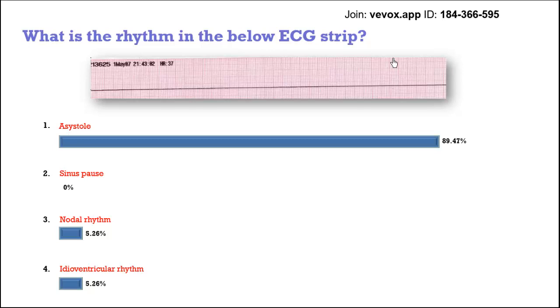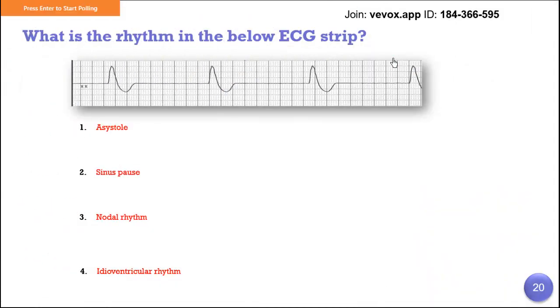But I told you before, once you see something like that in your patient's monitor, go and check the connection first. Second, you check the carotid pulse and you start the basic life support. Check the patient responsiveness and then check the carotid pulse, check the breathing. You cannot feel the pulse, no breathing, start CPR and call for help. But maybe you have only 1 or 2 electrodes off. So before you start chest compression, make sure that the patient is connected perfectly. Just have like 5 seconds to look at this strip, make up your mind, and then choose the correct answer.